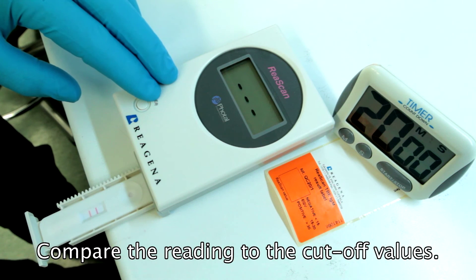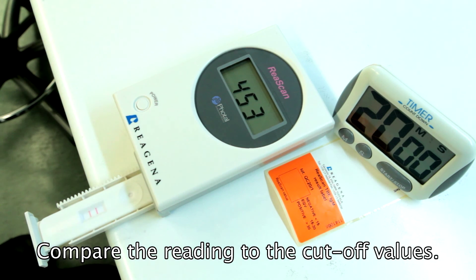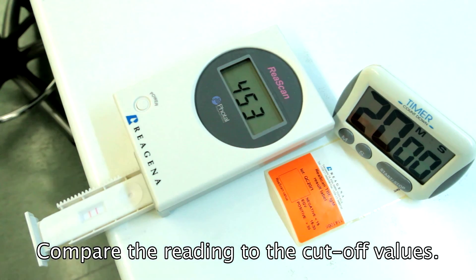Interpret the result as positive, equivalent, or negative according to the lot-specific cut-off values shown on the label on the inside of the kit's box lid.